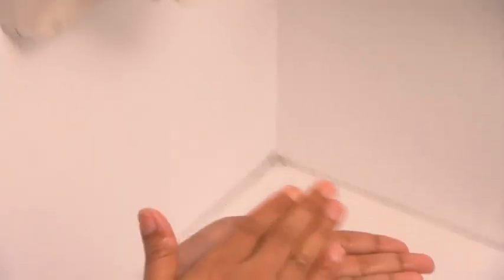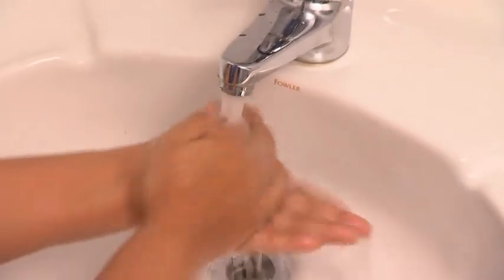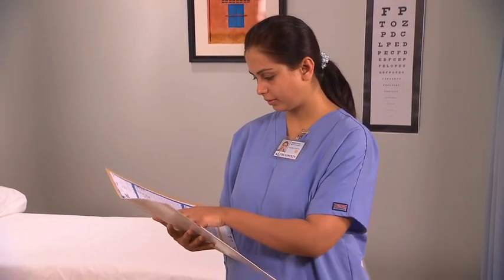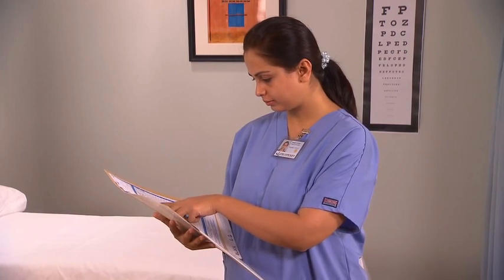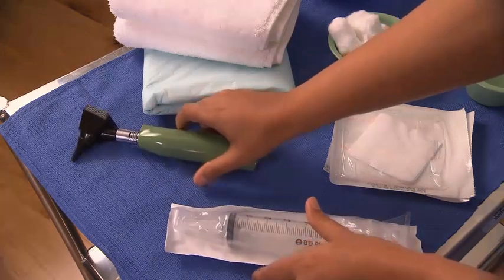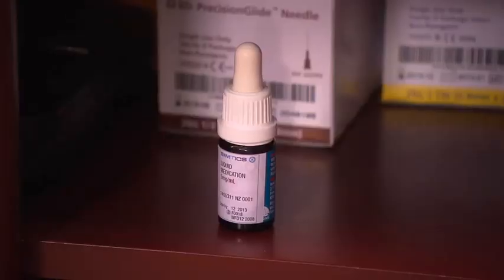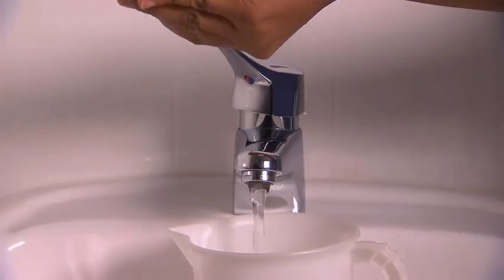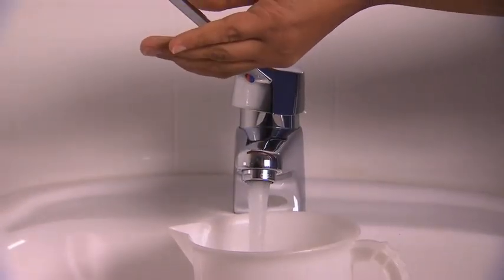Begin by washing your hands. Review the physician's order, noting which ear is to be treated, which medication or solution should be used, and the required dose. Set up the tray with the required equipment. Remove the ear medication from storage, and fill a jug with warm tap water to use as irrigation solution.